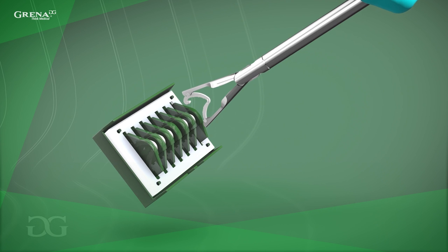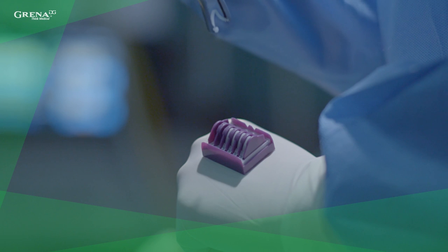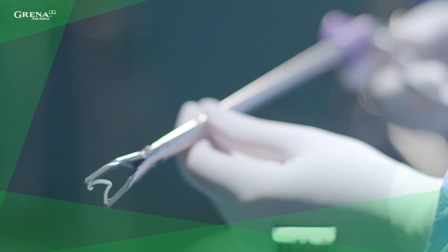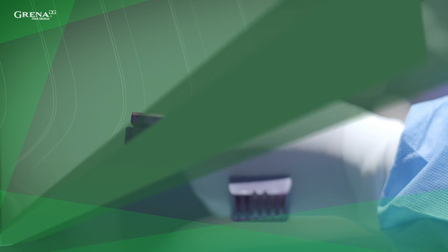In the next step, remove the clip from the cartridge using the Click-A-V clip applier. Make sure the clip is affixed in the jaws securely. The clip bosses should sit in the notches of the applier jaws. You should notice that with the polymer clip applier, the operator can make slight movements on the front handle without loosening the clip.